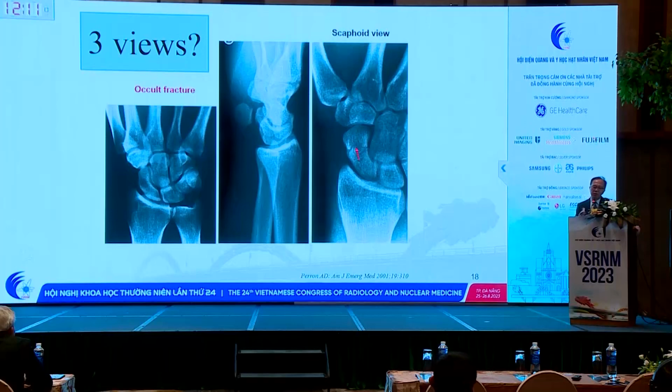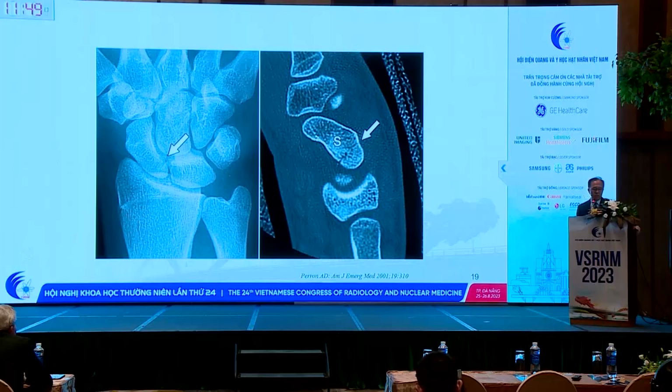So the third view is very universal in other countries, especially in the West, or they even do the CT scan. So how can we solve the problem? Ask the patient to follow up. Very important. Ask the patient to follow up in 2 weeks. From non-displaced fracture to displaced fracture, at least you can capture the fracture. So of course, if you have the budget, you can do a CT scan.